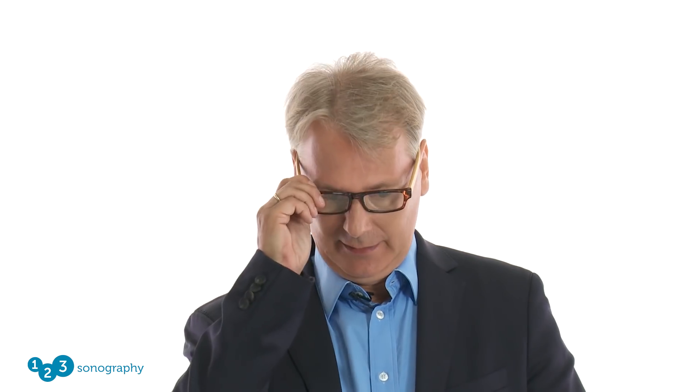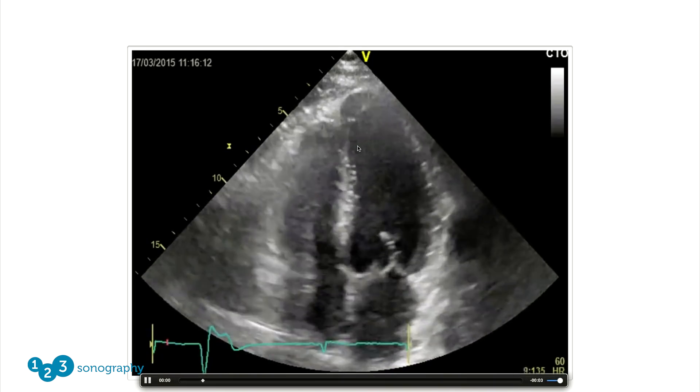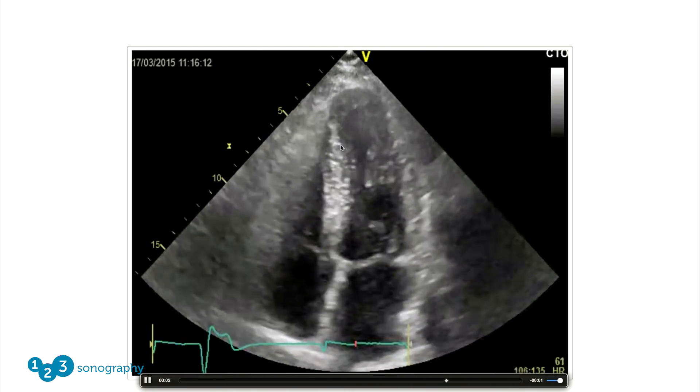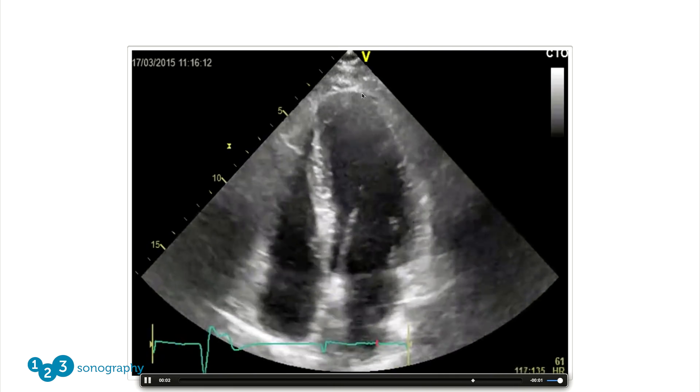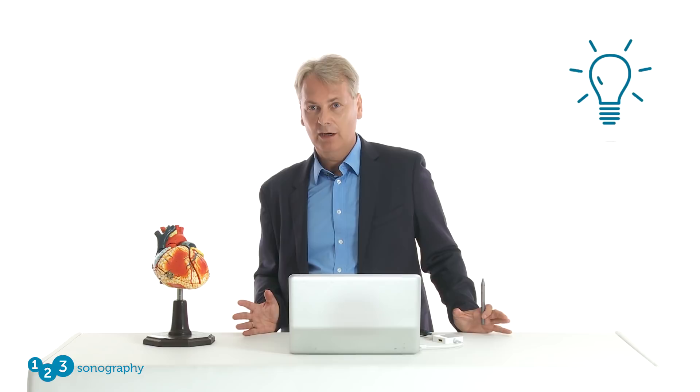Can you see what the problem here is? Take a look at the wall motion in the region of the apex. This is the apex, and if you look closely you will recognize that the apical segments do not contract normally. But is there anything else that you see? Yes, there is. To detect that, I would recommend Scott to do a little trick. Let me demonstrate on a model.